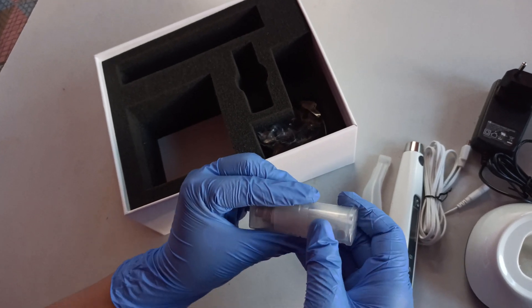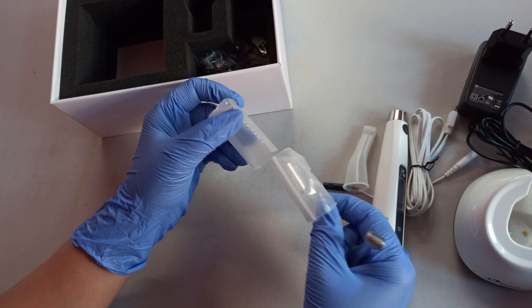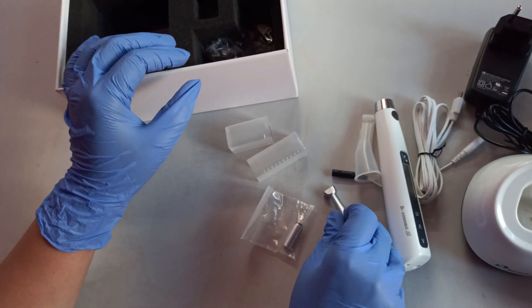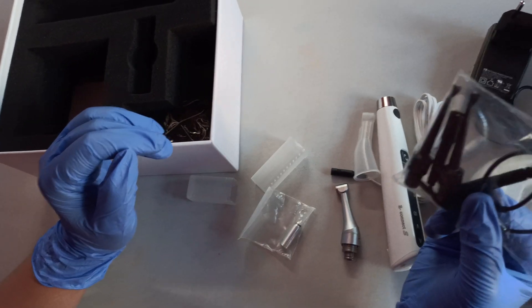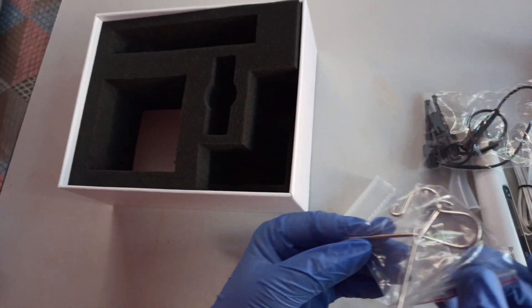Here is the counter angle handpiece which attaches to the motor handpiece. It also comes with an oil spray nozzle, as you can see, and two file clips and two lip hooks.